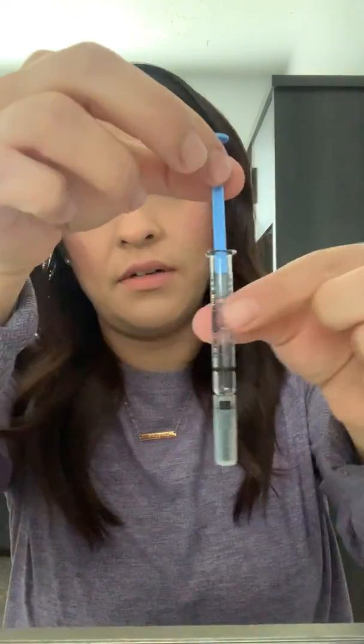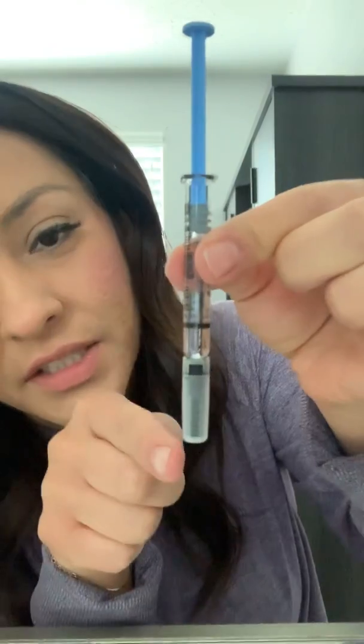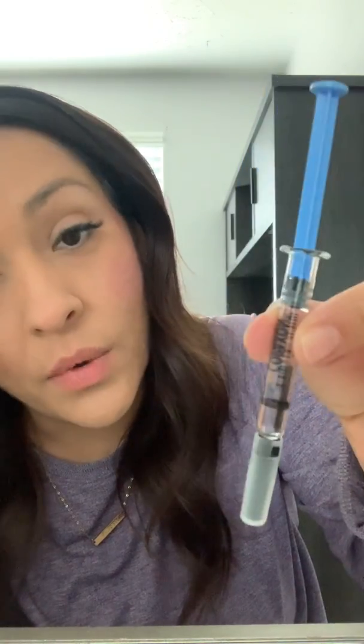Then you just take it out — Copaxone. And then there's the syringe, but you don't take the lid off because the auto-injector is going to take the lid off for me. If I wanted to, I could just take the lid off and inject myself, but it's a lot easier to do it with the auto-injector.